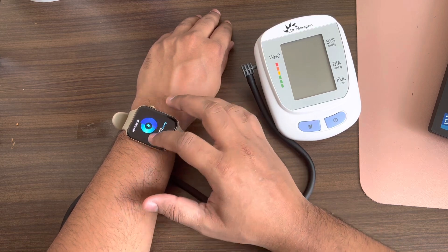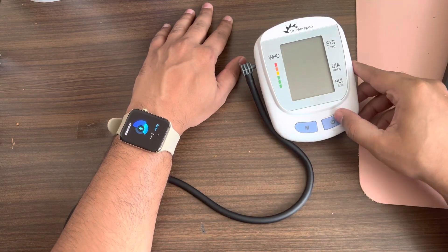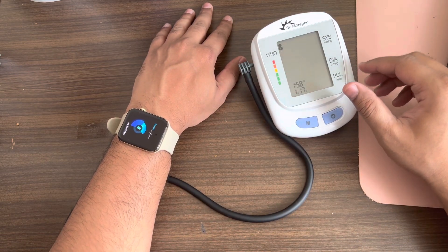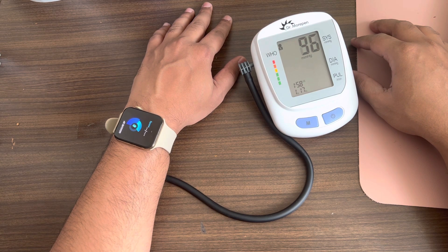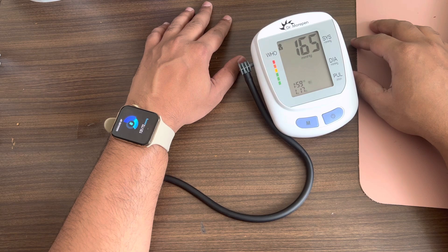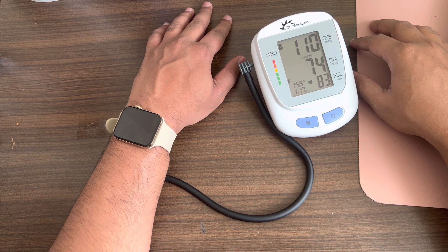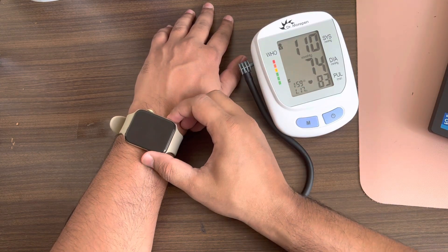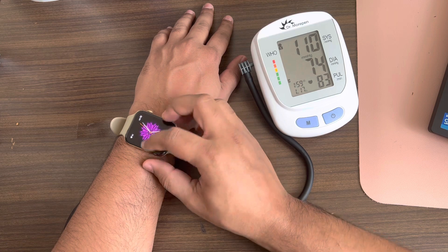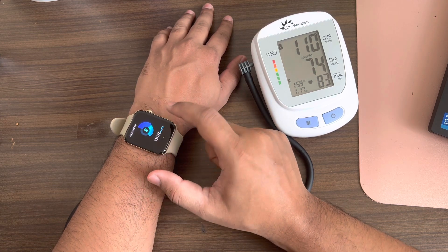Let me open the BP monitor and start it here. After waiting, the monitor is showing 110/74, and the watch has come up to 131/72.